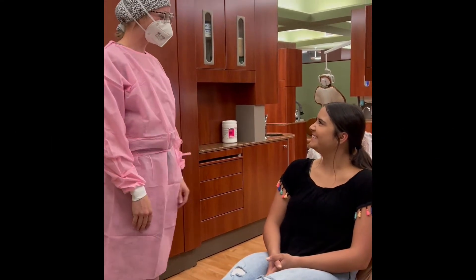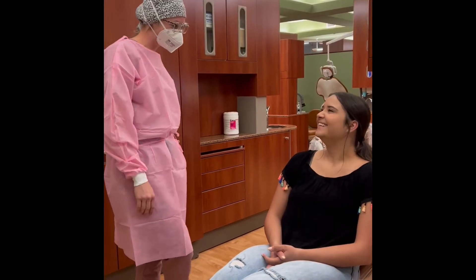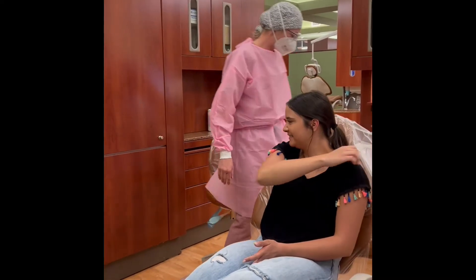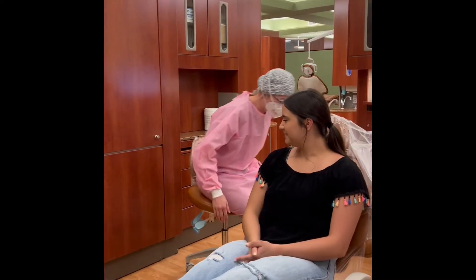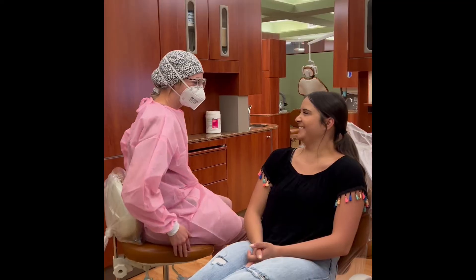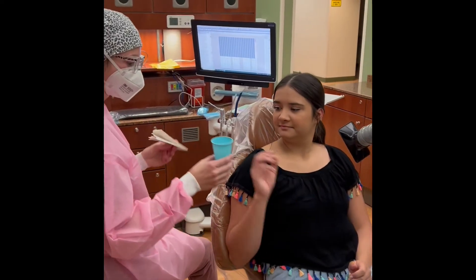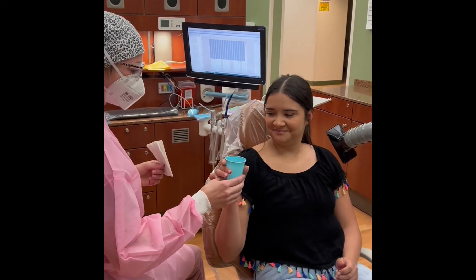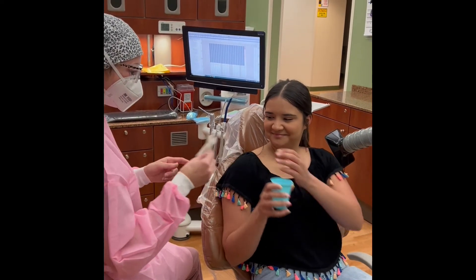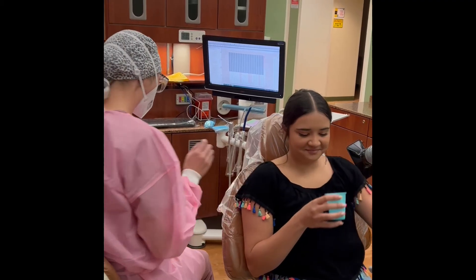Start with an overall appraisal of the patient. Observe the head, face, eyes, and neck, and evaluate the skin of the face and neck. Once ready to begin the exam, have the patient swish with an antimicrobial rinse for 30 seconds.